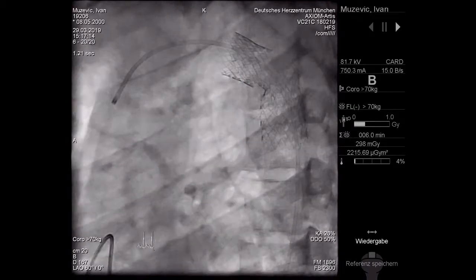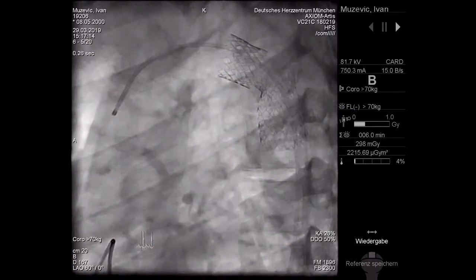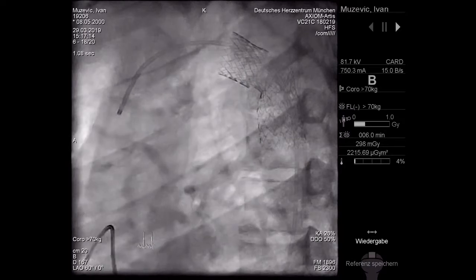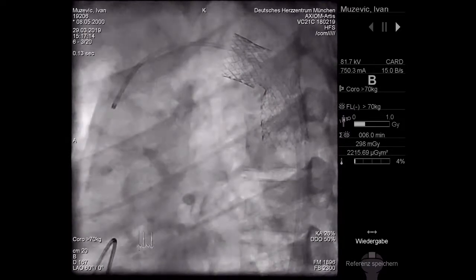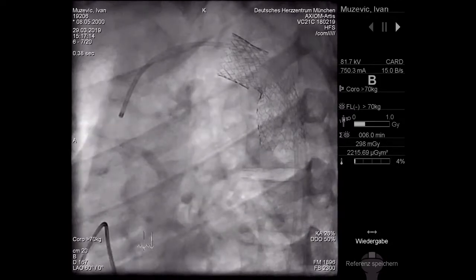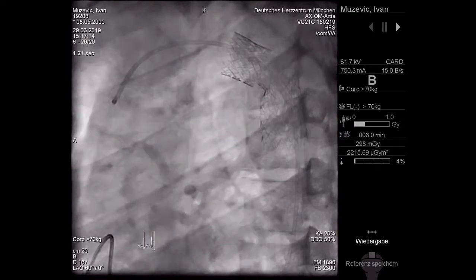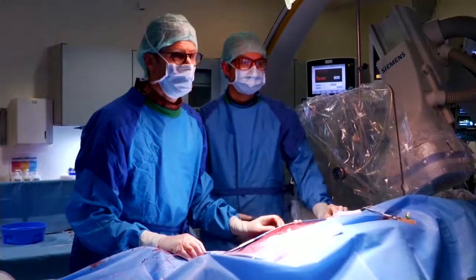And we take a longer 16 balloon, and we connect it, and then we open the subclavian artery. Okay, so we prepare this, and you have perhaps another talk or another live case, and when we are with the preparations so far, then we come back to you. Is that okay? We can see you here. Okay.